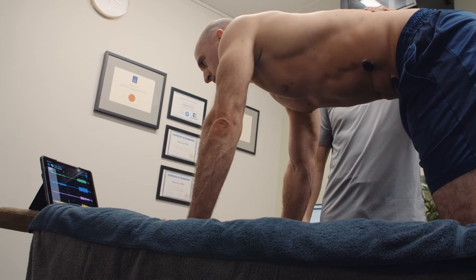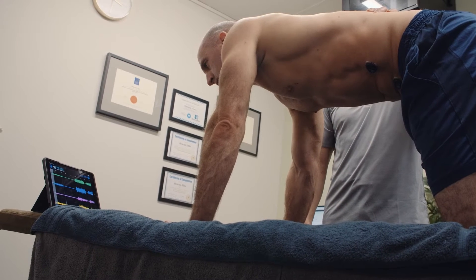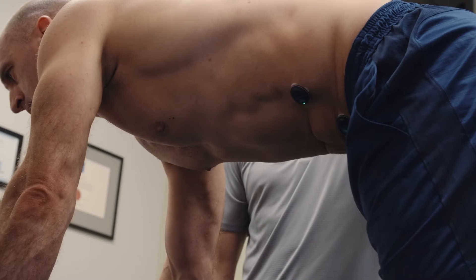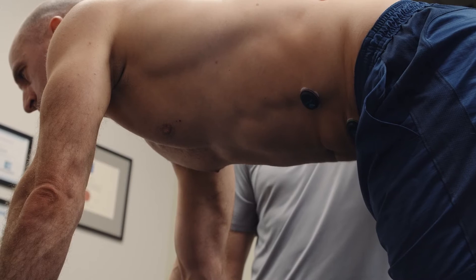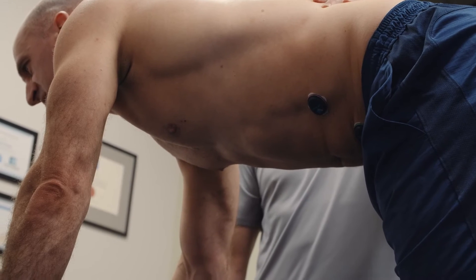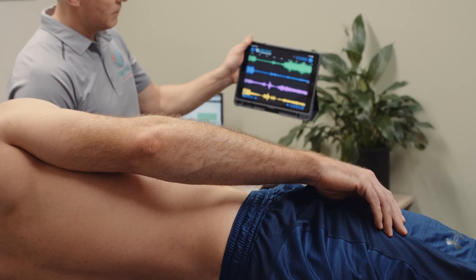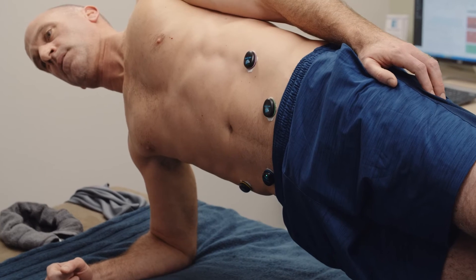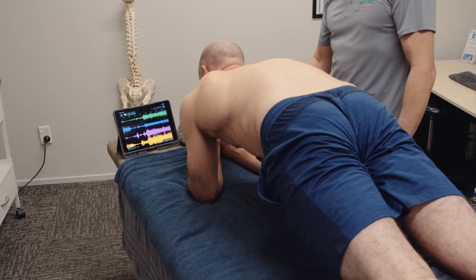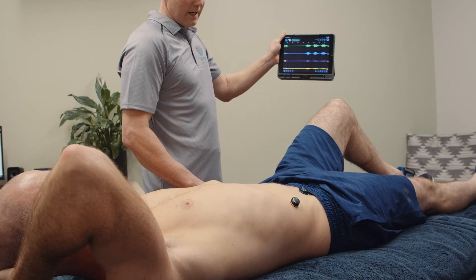Now test your subject's abdominal muscle output performing exercises, starting with four-point transverse abdominus engagement, followed by side bridges left and right, prone hold, and curl ups.